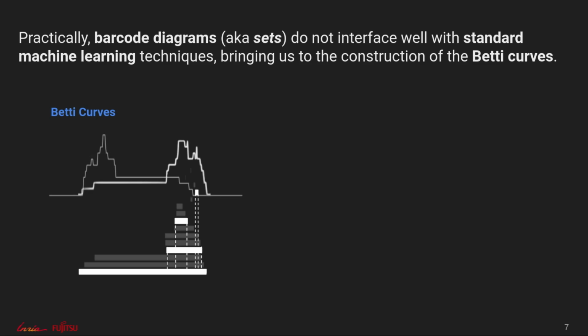There are multiple advantages, theoretical and practical, to using Betti curves. First, you control the sampling of the radius space, so your Betti curve will have as many points as you need, which also means granularity can be represented at its best. It also greatly helps with noise reduction, by keeping the bigger patterns and applying thresholds on the components you do not want to keep. TDA offers thus both an interface for global patterns as well as detailed ones.